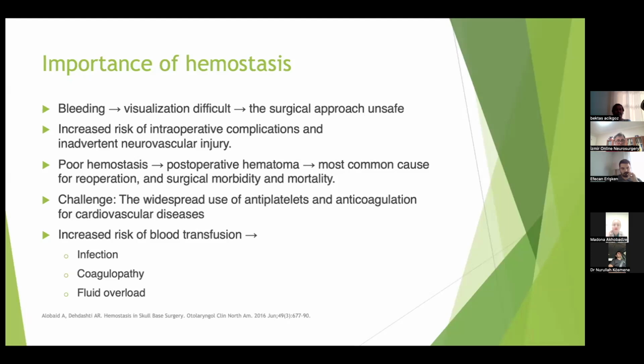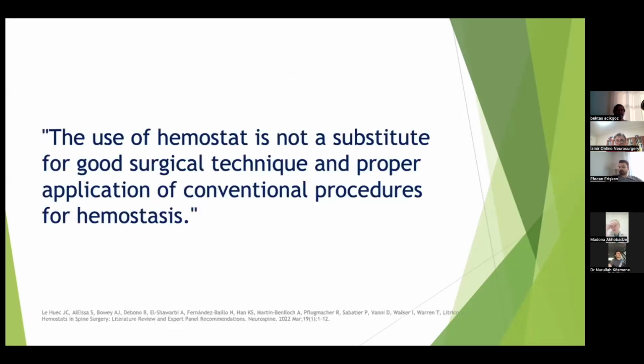take the theater. These days, the challenge includes managing patients who are on multiple antiplatelets and anticoagulation therapy, especially for cardiovascular diseases. And if there is more blood loss, we will have to transfuse blood, and this comes with the risk of infection, coagulopathy, and fluid overload. An important point to stress is that whatever hemostat we are using, the use of a hemostat is not a substitute for good surgical technique and proper application of conventional procedures for hemostasis.